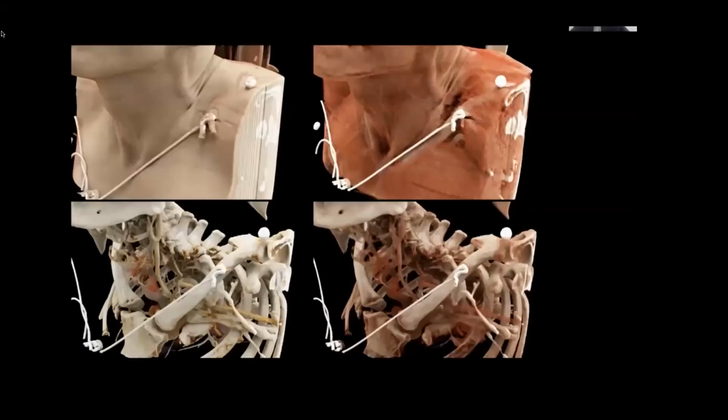First of all, I think you need to understand how these images are derived. By understanding how they're derived, that might give you a sense of how reliable they might be. So you acquire a volume of data, and if you think about the data in terms of tiny little blocks, we talk about voxels and pixels, right? A voxel is a volume element of tissue, a pixel is a picture element. So the volume element of tissue corresponds to the picture element that you see on the screen, right?